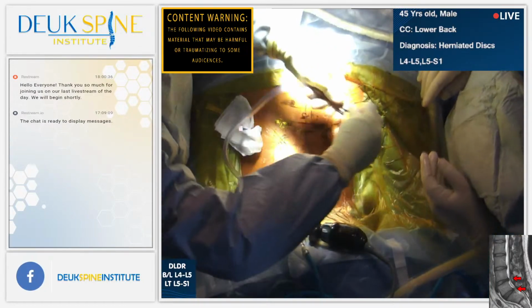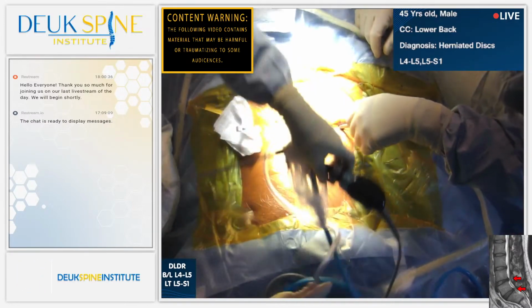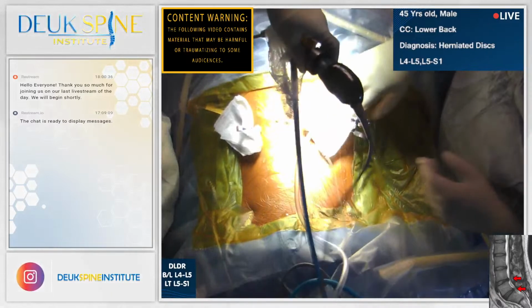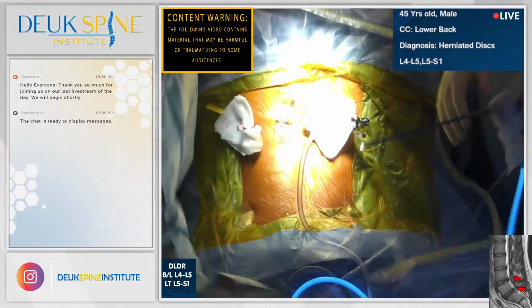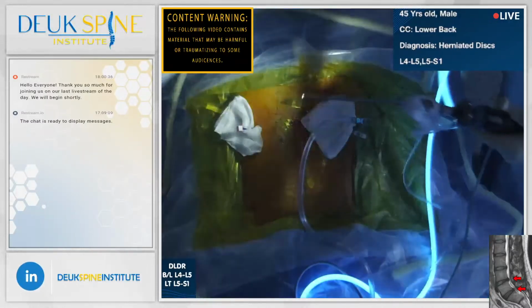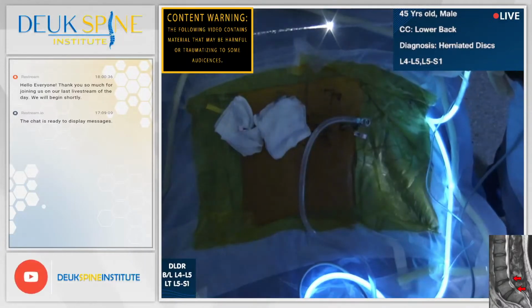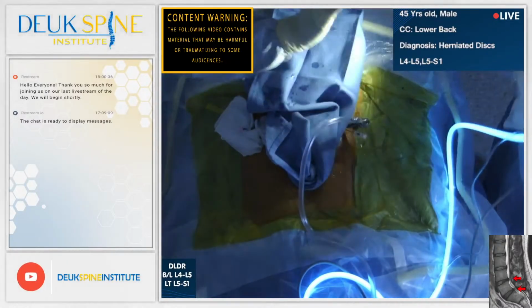All right. Long days, not enough oxygen to the brain. It makes for some really entertaining moments. Our patient is comfortably asleep, and we're getting ready to start fixing the first disc. I don't have any irrigation coming out. I don't know if there's been a recall on irrigation. All right, now it is.